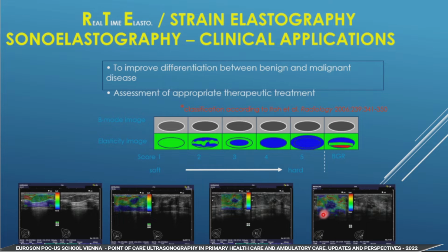The most important is score 3, which is here, benign or malignant. That's a very important discussion. But usually we use elastography with this score, and you have a specific score for water, so for liquid: hematoma, abscess, lymphocele, and you have the blue, green, red signs. It's a specific sign. It's not an elastographic sign. It's just a physical relation.